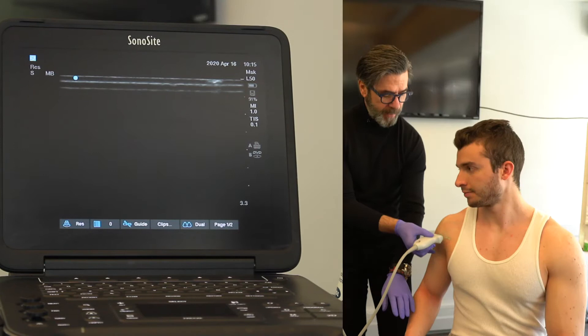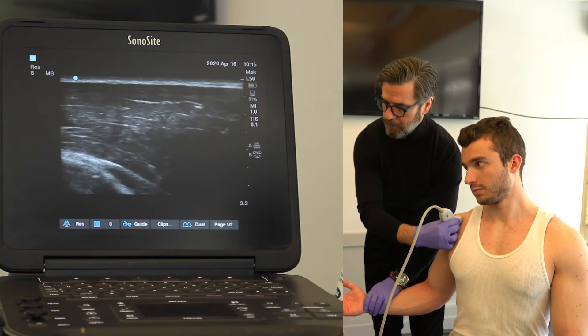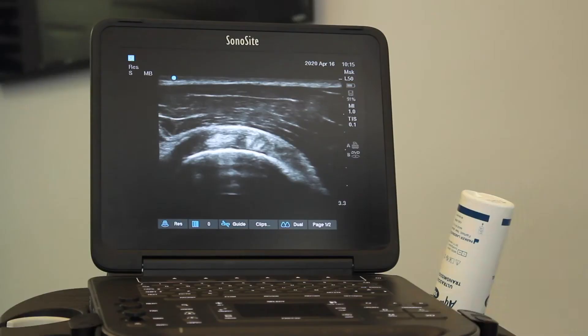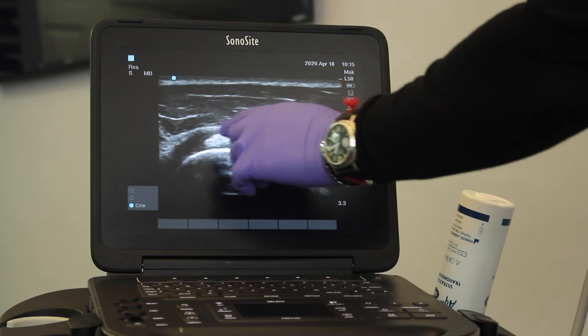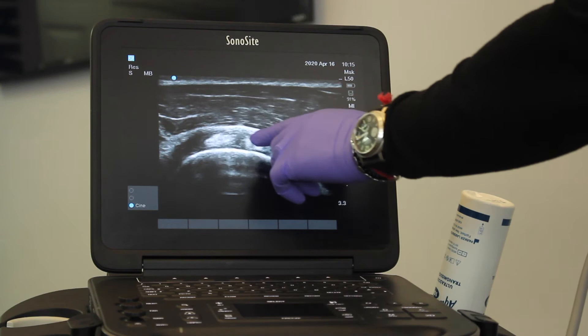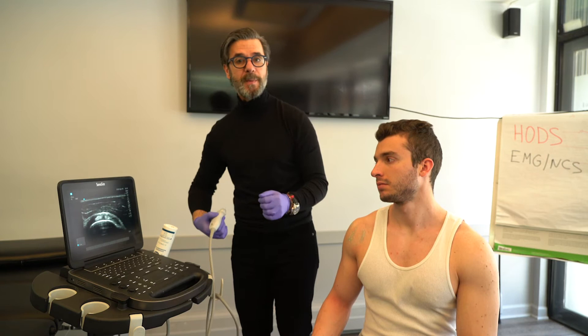Now I'm going to look at the subscapularis in long axis. I'm externally rotating the humerus to get this view. That's the subscapularis in long axis — you have those three circular structures, and this is where the muscle becomes tendon. This is a very typical view of a healthy subscapularis.